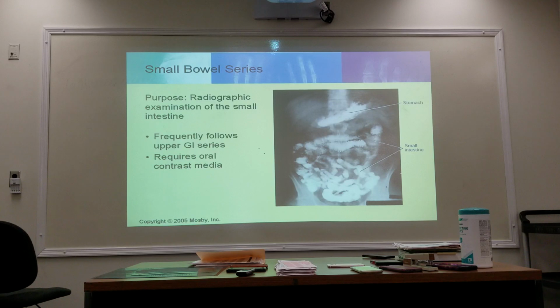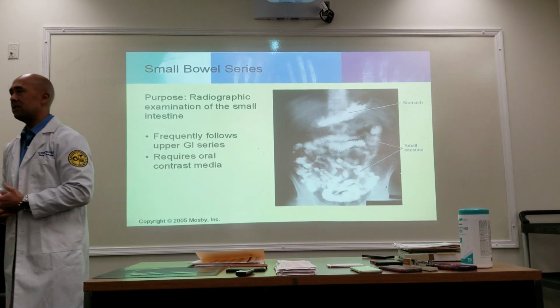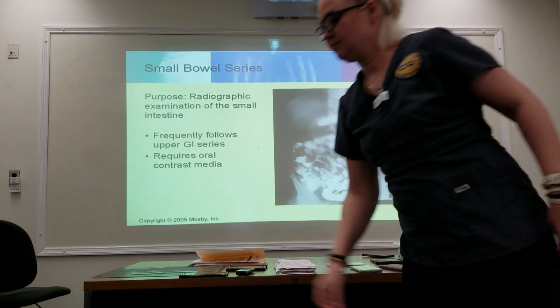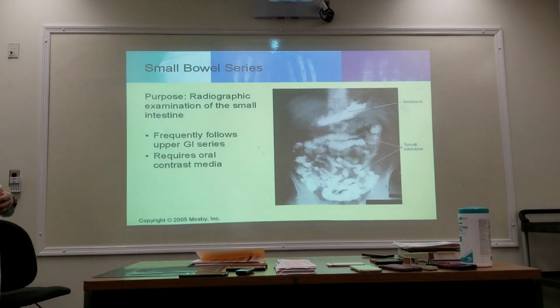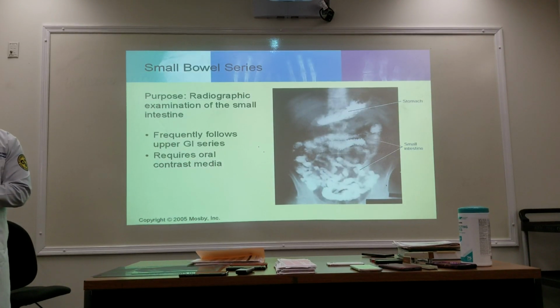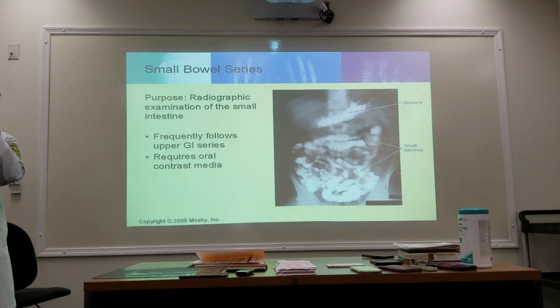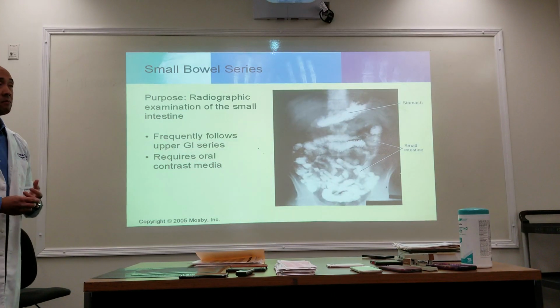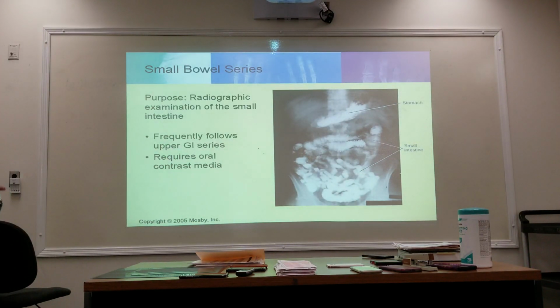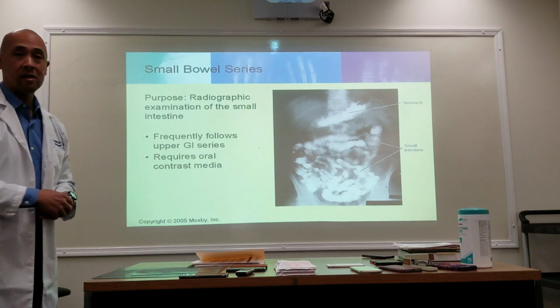So with that said, if we're looking at a small bowel, what do you think a contraindication is? I mean, I'm just jumping ahead. What do you think a contraindication would be? It's going to be just like what? The upper GI. So talking about perforation, blockage, what else? Is there anything else? Recent surgery, pre-surgery. Pre-surgery in that, if they are going to have some kind of abdominal surgery, you want to schedule that barium exam so that there is enough time to evacuate the contents.